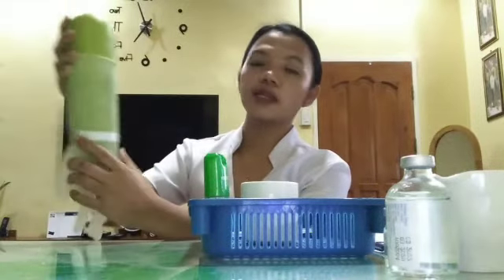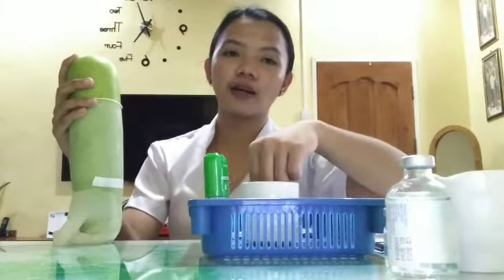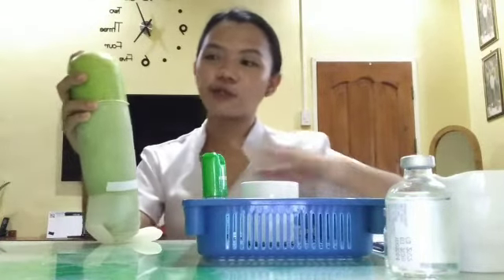So we will be injecting the drug on the deltoid muscle. So here it is, the deltoid muscle. We will be checking the site for any bruises or scratches that are present.